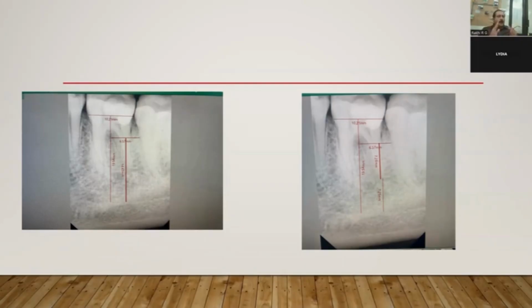Yeah, that interradicular area, furcation area, should be clean and clear for the interradicular bone to become interdental bone in future. If you happen to have any projections of furcation over the interradicular bone, you will not get good healing. So open a flap, make sure that this tooth is made into a complete premolar without any additional projection over the interradicular area or in the furcation area of the tooth. Sectioned in such a way that it is completely restricted to that premolar size, not any projection into the furcation area. Make it clean, then evaluate the bone, decide on the final size.